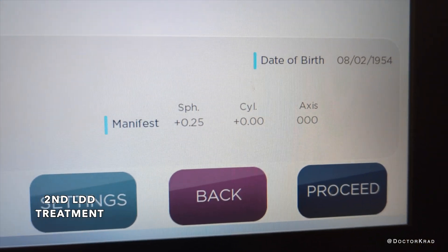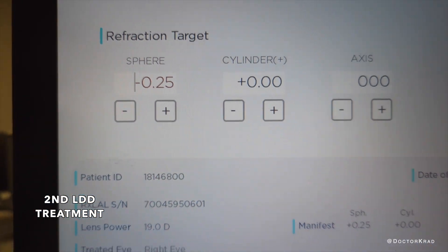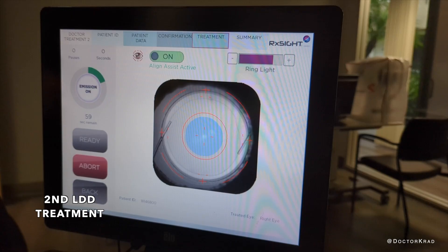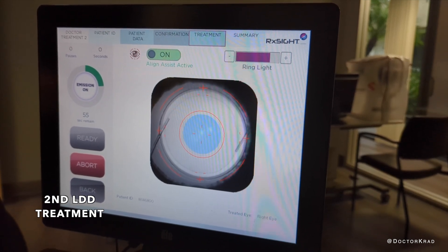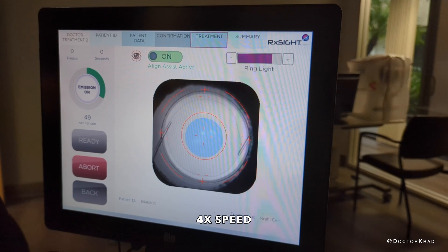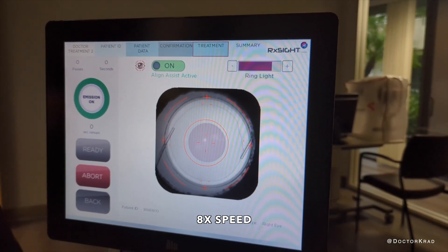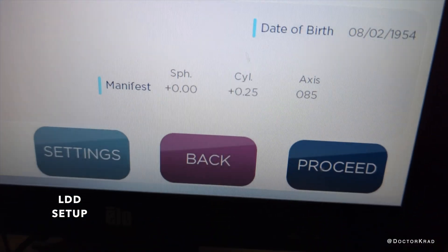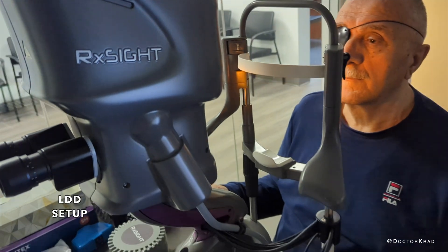The manifest refraction is plus a quarter, and our target is minus a quarter — this is the dominant eye. On the second eye, there's the refraction, and this is our target. This is the way we set it up: we just have one eye covered, and then the second eye exposed, and then we're going to do the light treatment.